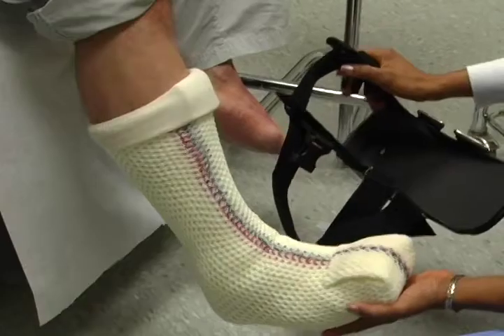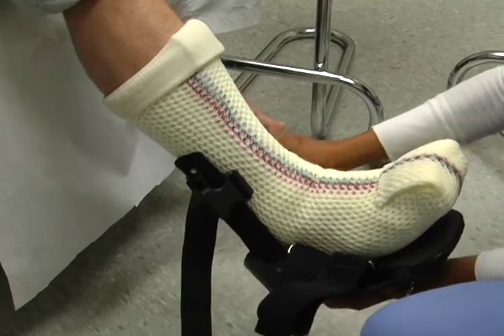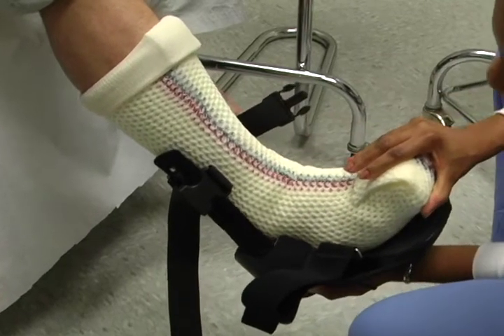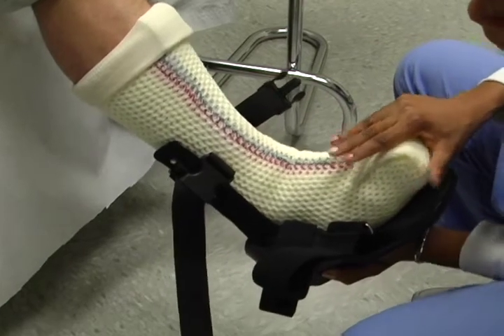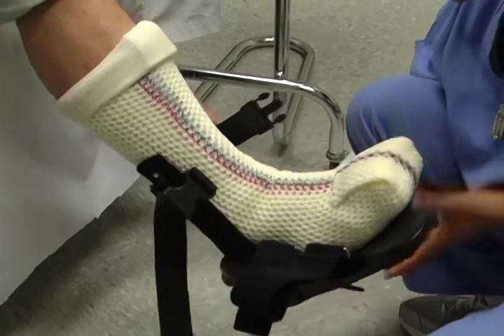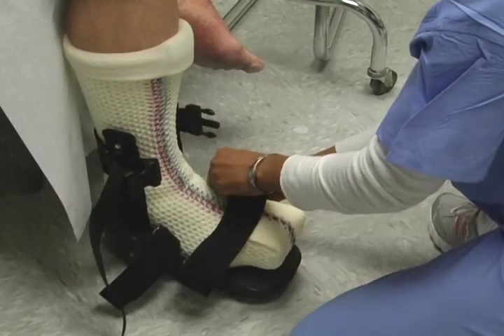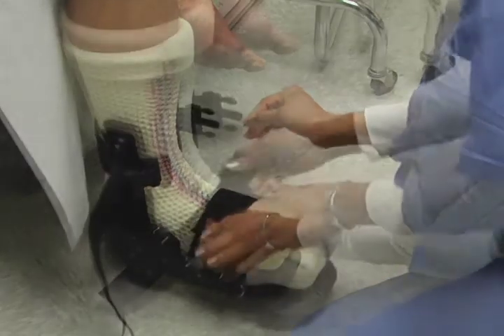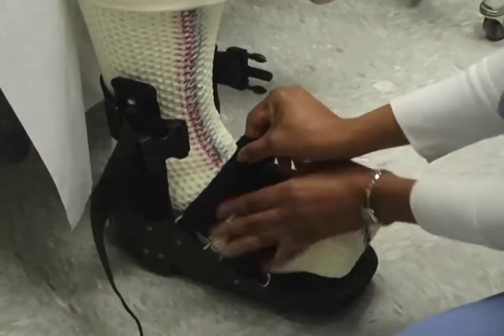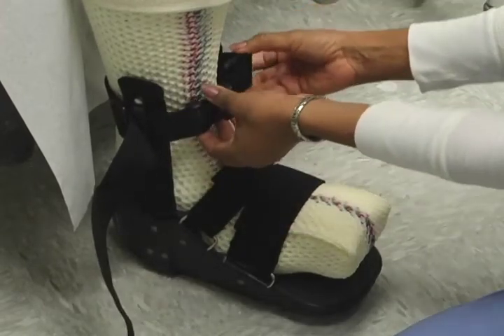Step 9. Outer boot. Once dry, apply the outer boot by placing the hardened cast between the upright struts of the walker boot. Ensure the struts are aligned with or are parallel to the patient's tibia and fibula and place the heel of the foot at the rear of the boot. Secure the toe strap, the ankle strap, and the top strap.